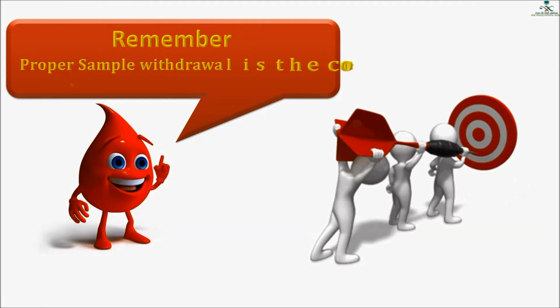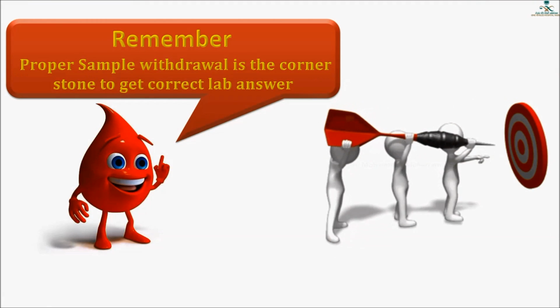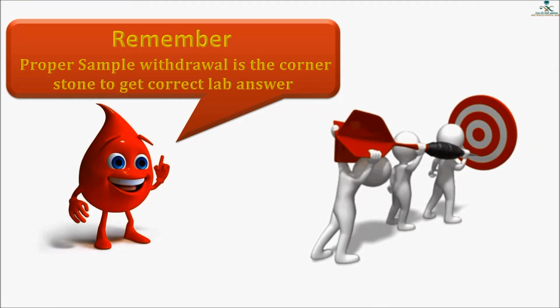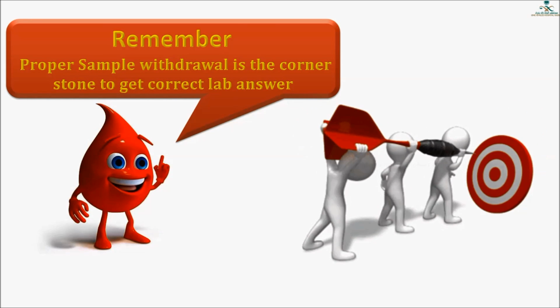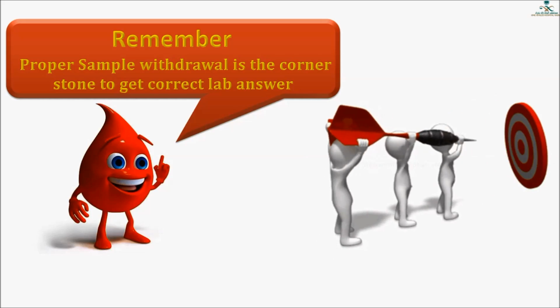Remember, proper sample withdrawal is the cornerstone to get correct lab answer for a clinical question. All should cooperate together to reach our target.